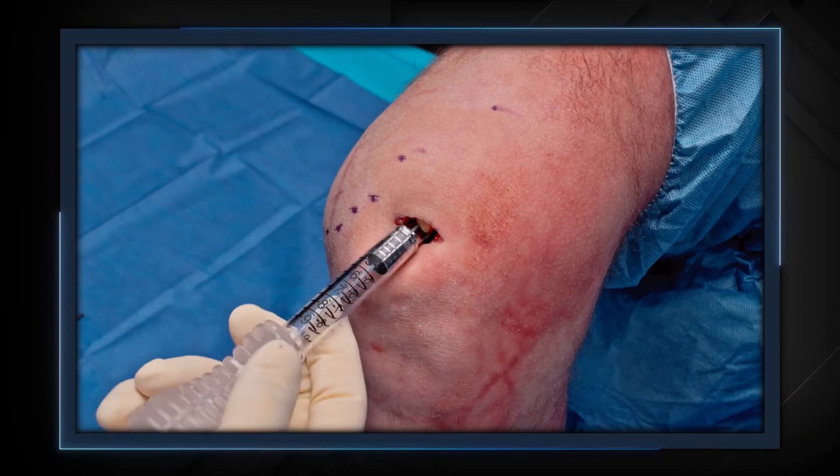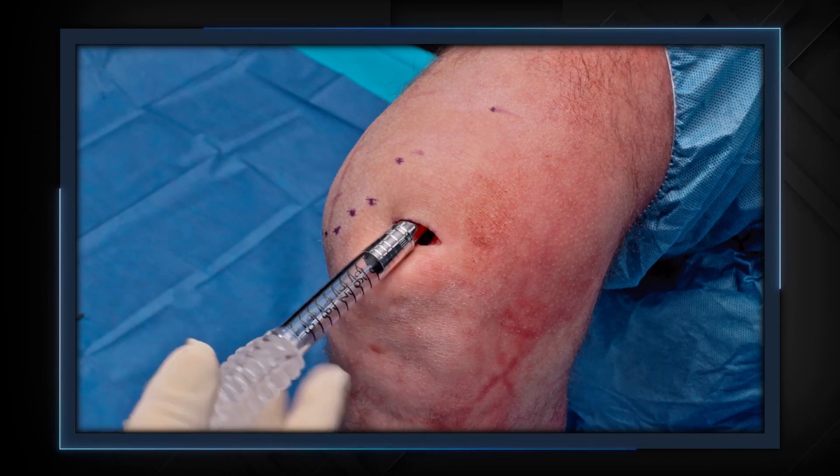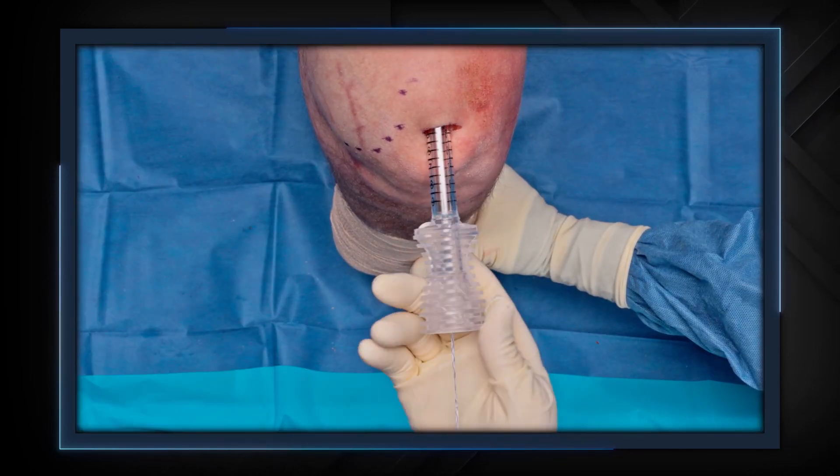That's very important. The other part that I really like is it's all wrist. I keep my elbow at my side so that I'm not moving the quad pro. It's very sharp, so you don't want it to go off track. If you get the quad pro in, don't pull too much tension on your sutures and just let it find its spot. Keep it in that native position. When you get it through that distal three centimeters you've elevated, just keep it in that position — it doesn't skive down, it doesn't skive up. Just hold that and it will pull the graft out for you. It's like cutting butter. Don't over-force it, just let your leg hang naturally and turn it 360 degrees. It'll cut nicely and measures perfectly.